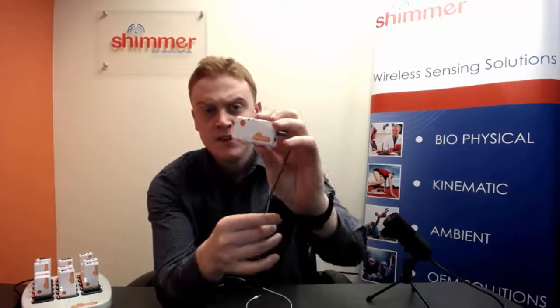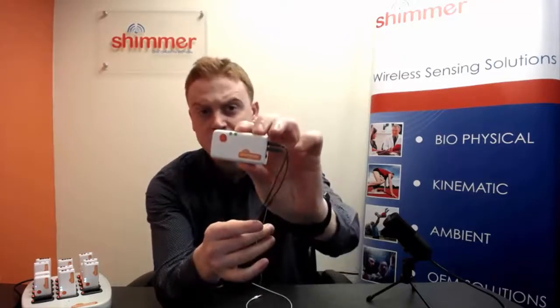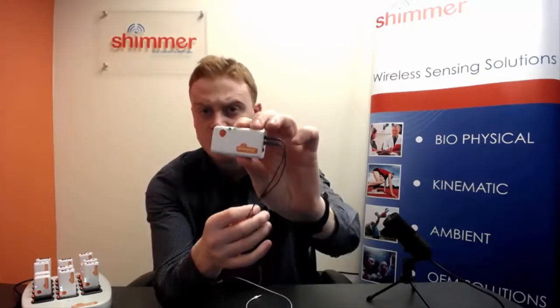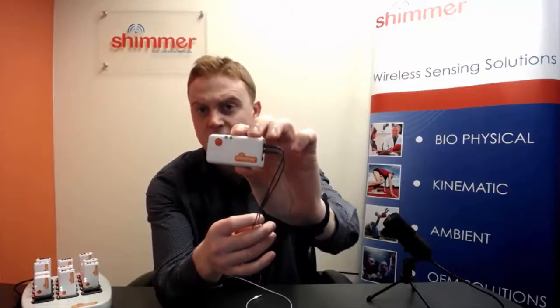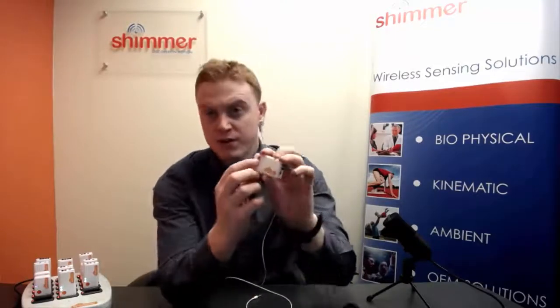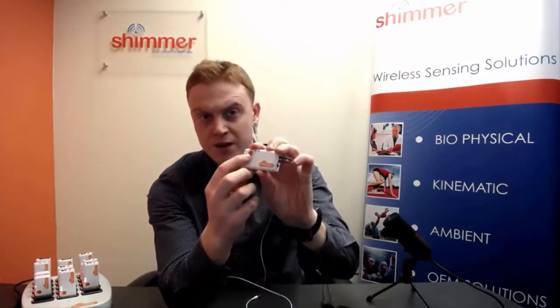The LEDs on the shimmer unit indicate what communication state they are in. The other option, which was the user button, if I had selected that by pressing the unit on and off with the user button here, would log to the SD card or not.